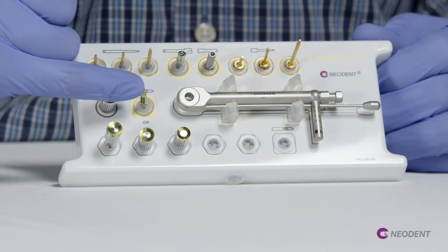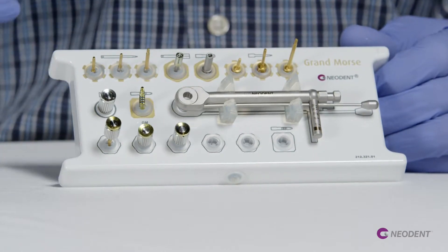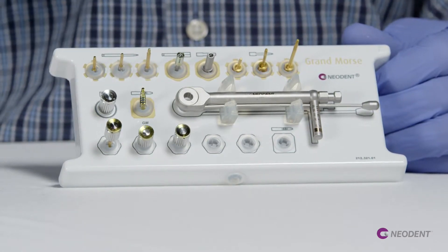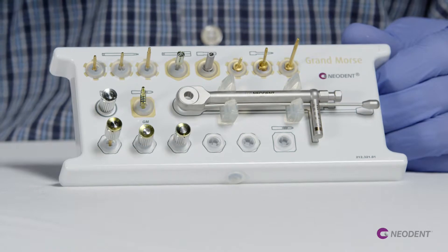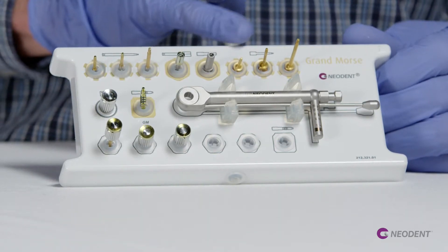This is the height measure tool — the same we have in the surgical kit — to take the measurement of the soft tissue. And here is the torque wrench to use with the torque drivers.